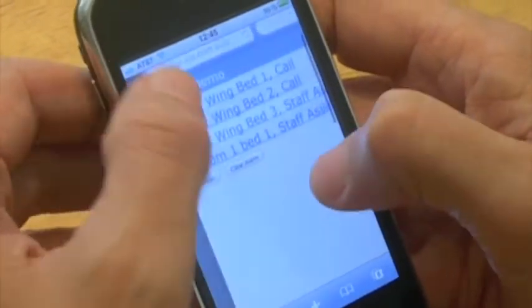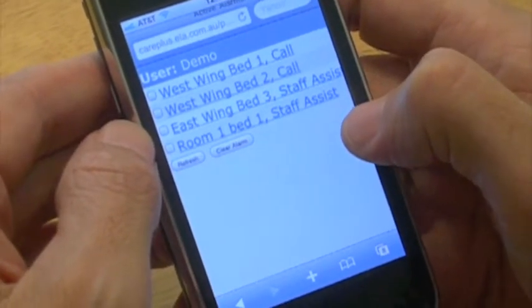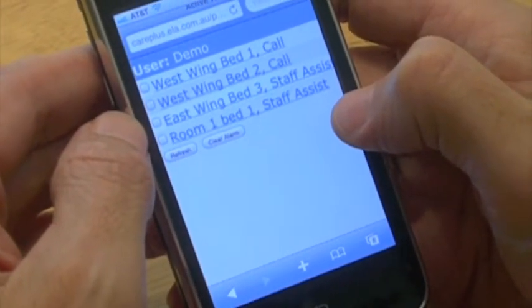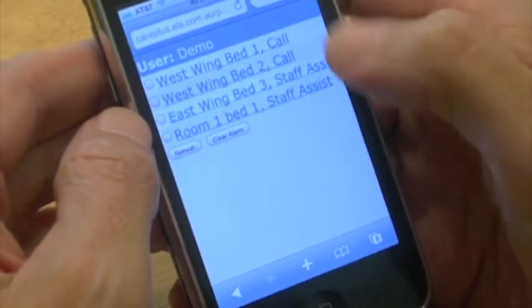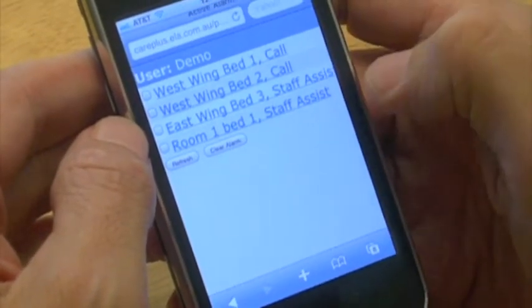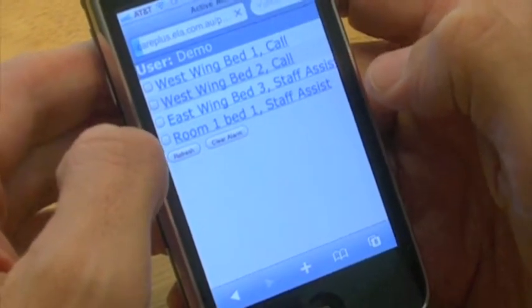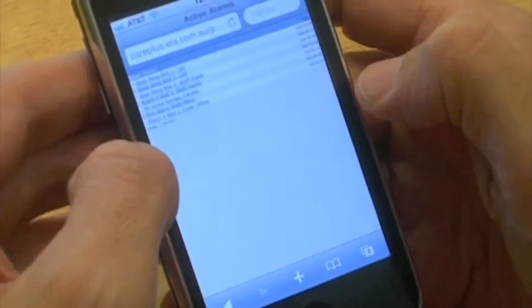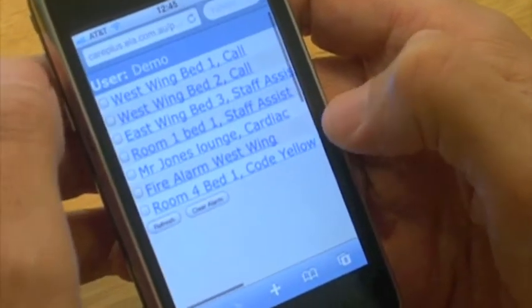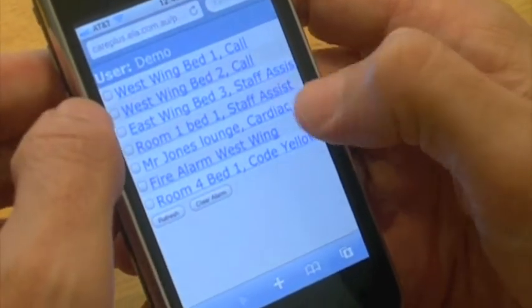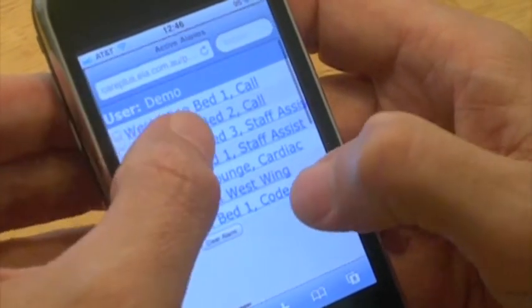Just assume I'm the nurse manager and I'm off campus and I want to know what's going on in my particular care area. I can just have a look here and we can see that there's four active alarms currently on my care area. That's just refreshed and now there's six, seven, eight active alarms.